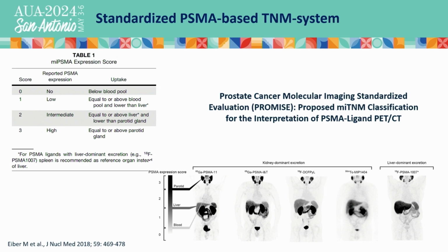Last but not least, I will allude to the prostate cancer molecular imaging standardized evaluation protocol, PROMISE, which is very important in clinical daily routine. I don't know how it is in your place when you send a patient for a PSMA PET CT scan and you receive the report, and sometimes it's a little bit vague. There is a little bit of SUV increase at a specific space. We don't know if this is metastatic disease. It could be metastatic disease. There's a high likelihood, so nothing you can work with to counsel your individual patient.